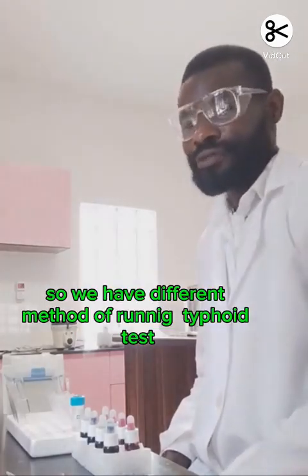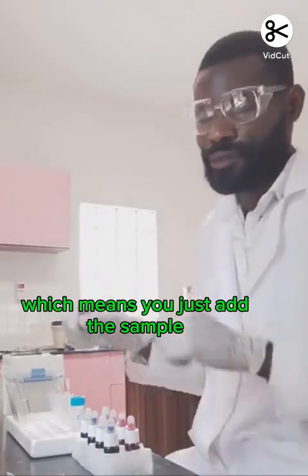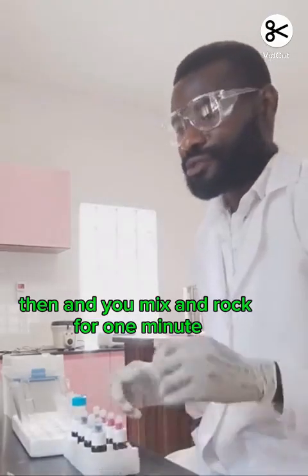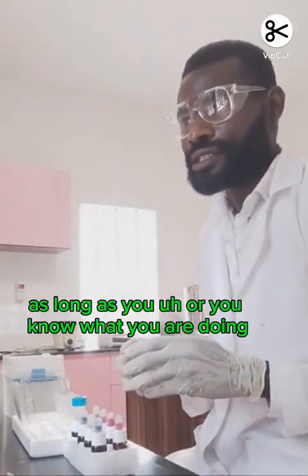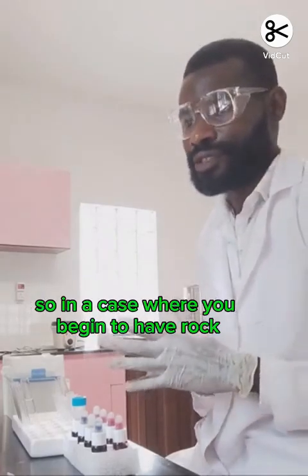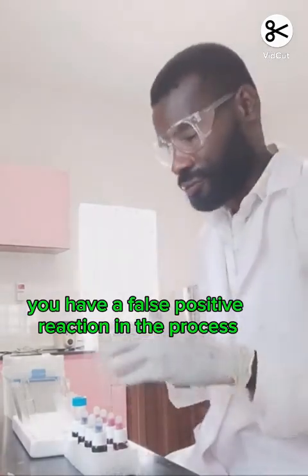We have different methods of running the typhoid test. There is the slide method, which means you just add the sample, the serum, and the febrile antigen, and you mix and rock for 1 minute. You get your result. As long as you know what you are doing, it shouldn't be more than 1 minute. If you rock for more than 1 minute, you have a false positive reaction in the process.